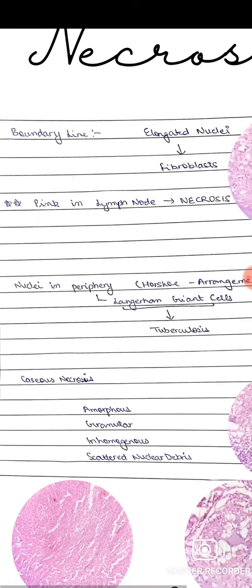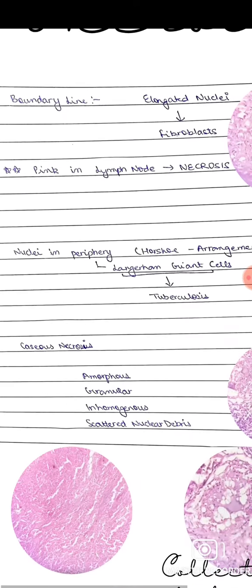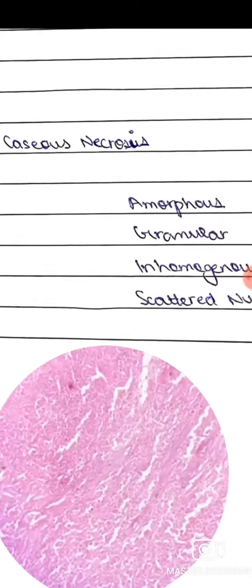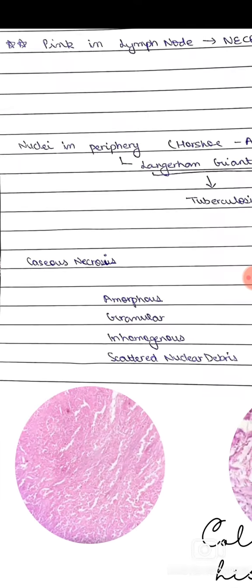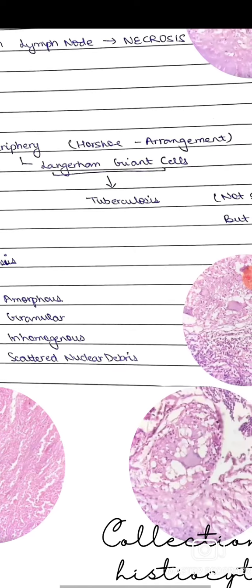Which type of necrosis is this? The material we can see is amorphous, granular, inhomogenous, with scattered nuclear debris. This is characteristic of caseous necrosis.